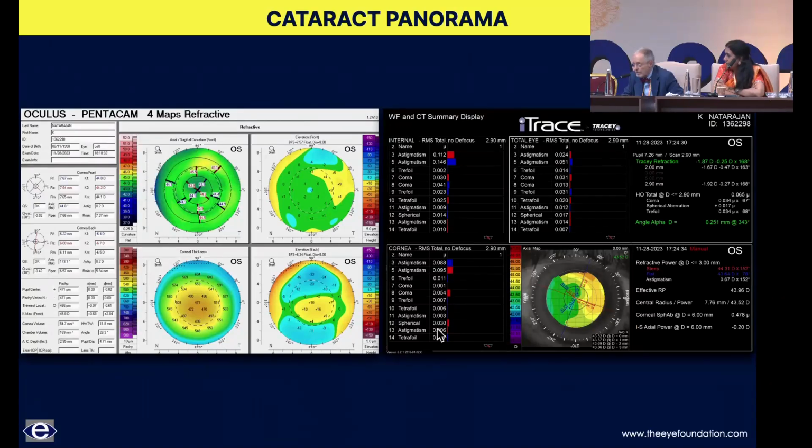But I do agree that the topography looks quite uniform and with a low correction. I'm sounding like David Chang, but I usually do light adjustable lenses in these patients now. But this is interesting. This kind of patient would also be interesting with the new J&J PureSee. It'd be interesting how they do because of the absence of diffractive rings and the continuous curvature. Or maybe an EDOF toric.